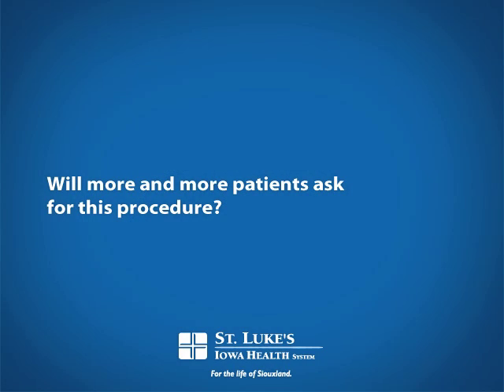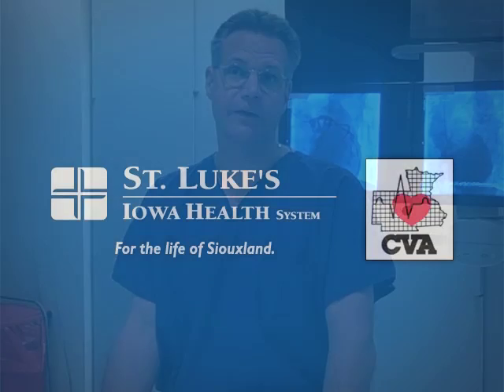But you feel as time goes on that more and more people will start seeing the benefits of this, become more aware, and ask for it. Absolutely, and we already have patients now who come in, and physicians who are referring patients to me who specifically would request this. And it's particularly helpful in patients who are older, if they have other orthopedic problems, back problems where they simply can't lie flat for a period of time, patients with other comorbid medical problems, lung problems where they can't lie still, or even those who may be obese who would have great respiratory difficulties if they were required to lie flat for extended periods of time.